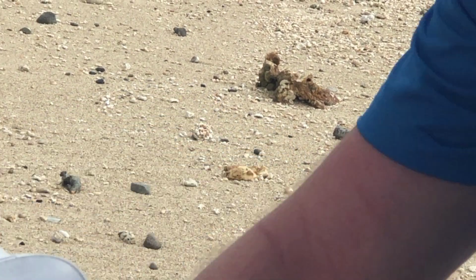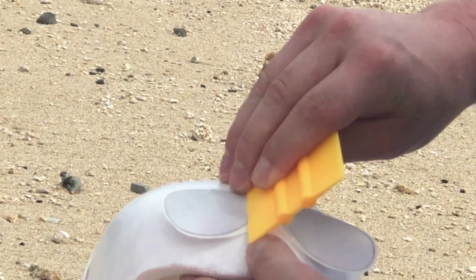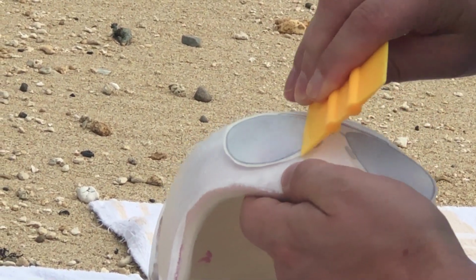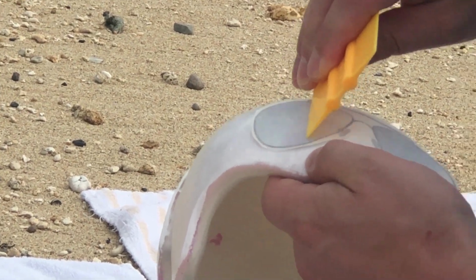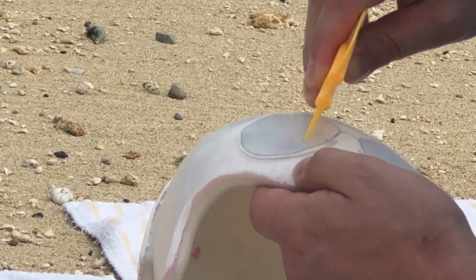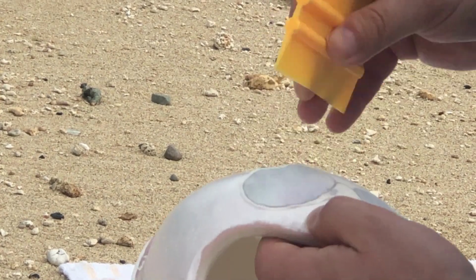I have done these many times, and sometimes even I feel I could have done better. In all of our designs with goggles and glasses, you should be able to get 2 more copies for just a little bit more money. Then you can practice a little if you are after perfection. With large decals, tack them down in the center, and then slowly work to the edges.